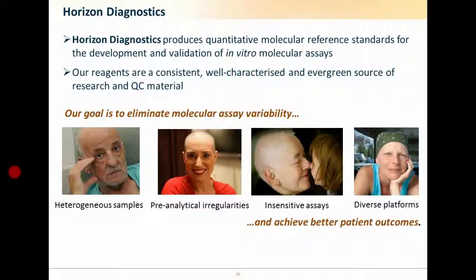In building the quantitative molecular reference standards that we have, it allows kit developers and kit manufacturers to optimize new kits for the targets that we've spoken about, but it also gives molecular pathology and molecular diagnostic labs the ability to test the limit of detection of their assays in validation studies, as well as testing on a batch-to-batch run to ensure that molecular assays are working on the day that they're being run.